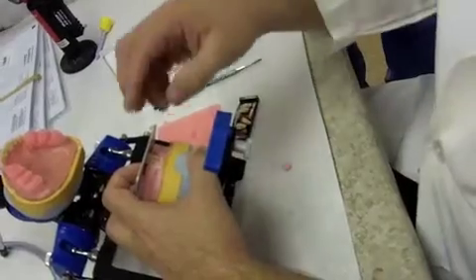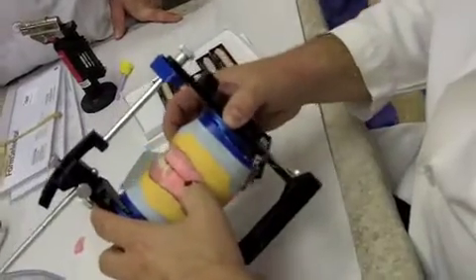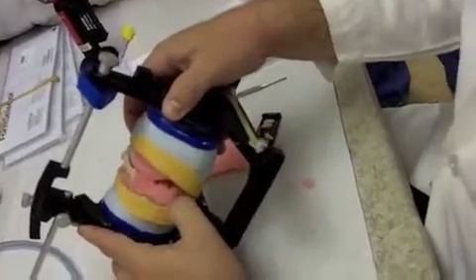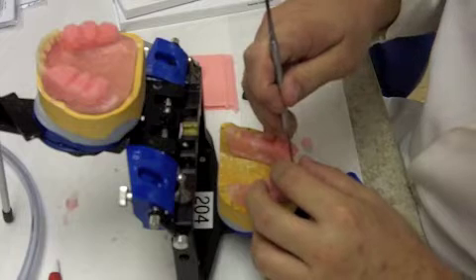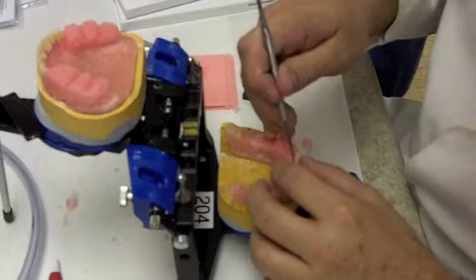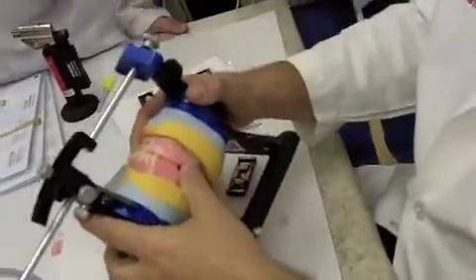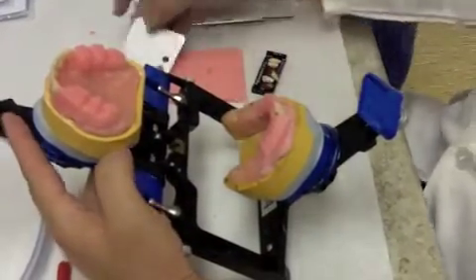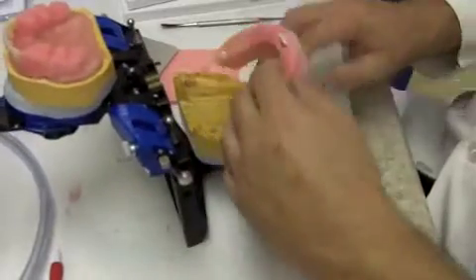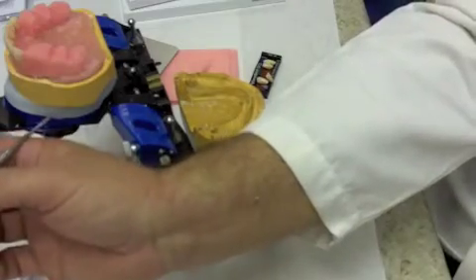Recheck everything: make sure you still have the vertical and horizontal overlap you want. Spend time with these central incisors getting them properly positioned before moving on. Another common problem besides having cervicals out and incisal edges in is students not getting the centrals in a good position and then moving on to set the laterals — a problem that just exponentially grows. Keep going back to that plate, make sure you're on your plane, midline is lined up, and you have the vertical and horizontal overlap you want.